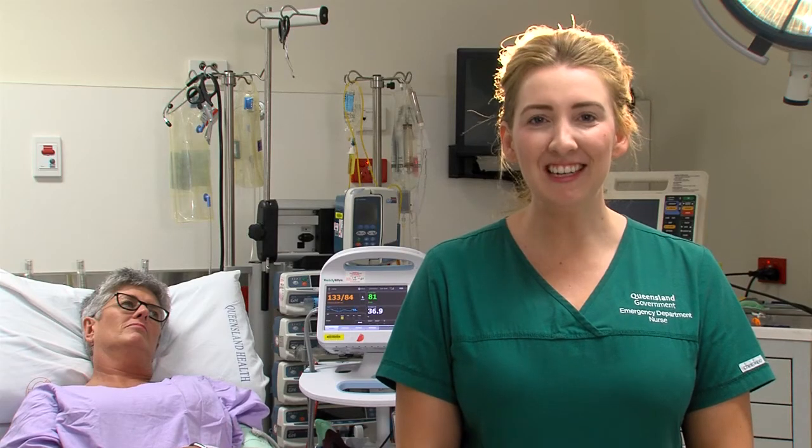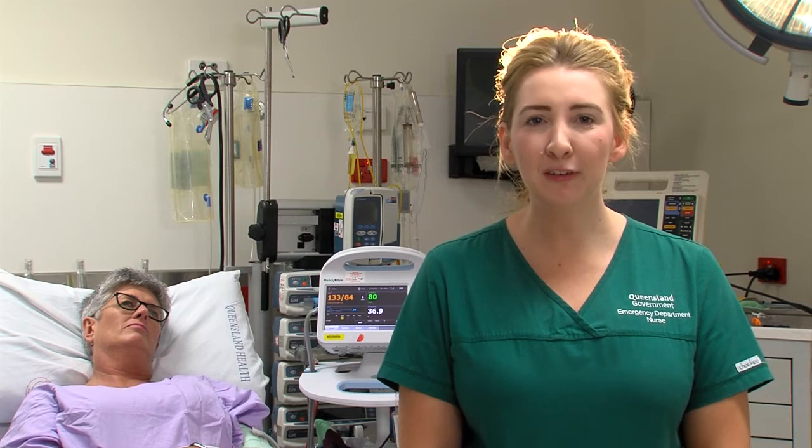If you encounter any issues with your Pyxis med station, please refer to your PAED Pyxis support documentation.